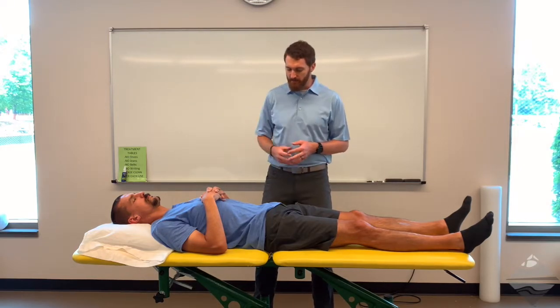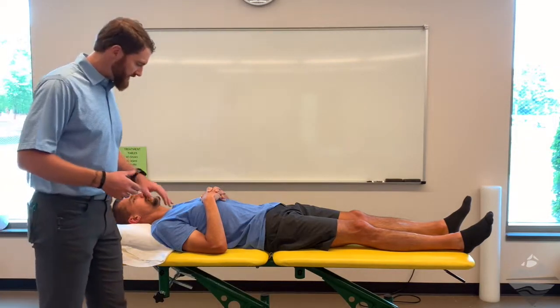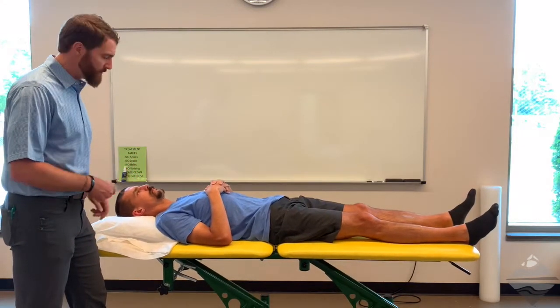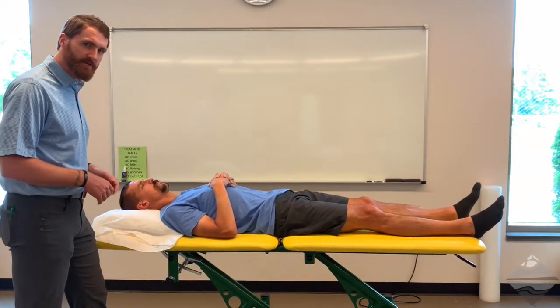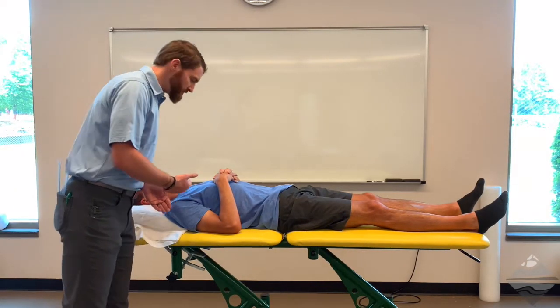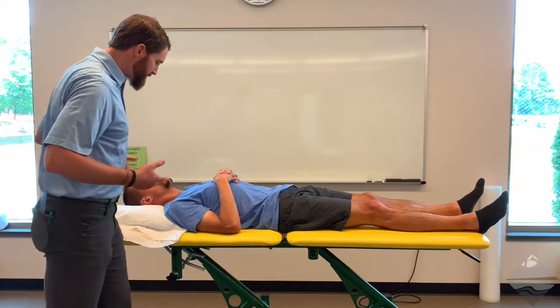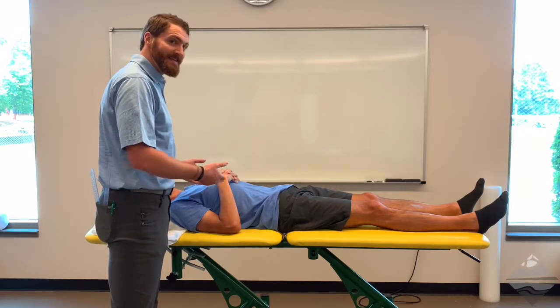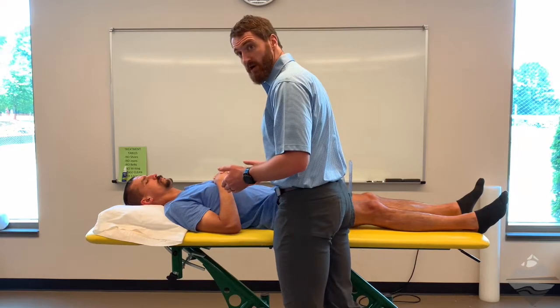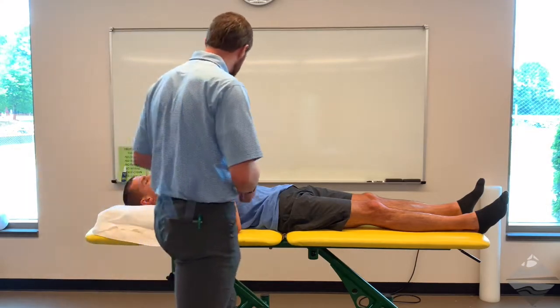I'm going to come around to the opposite side so that you can see on the side closest to the camera. I'm also going to bring my patient up on a high-low table. Be mindful of body mechanics as you're taking these measurements so that you have a closer working relationship and aren't having to bend over to gain your measurements. You can approach from different directions — just be mindful that you may need to move.